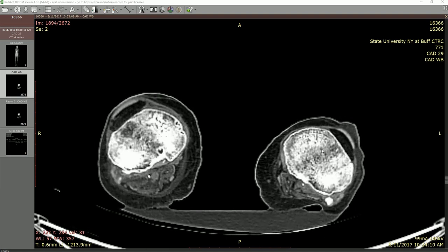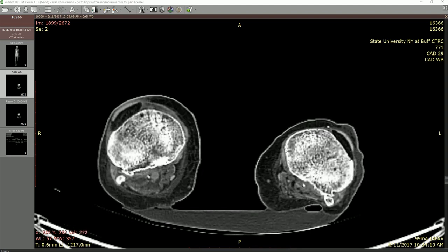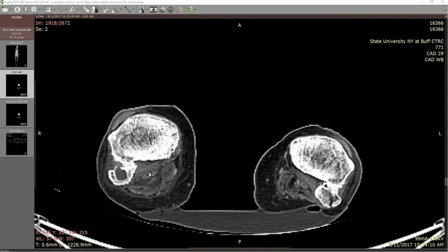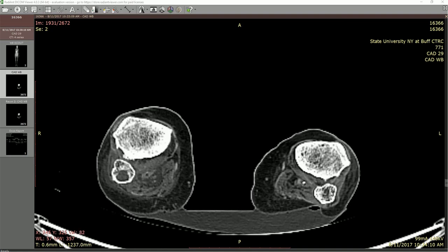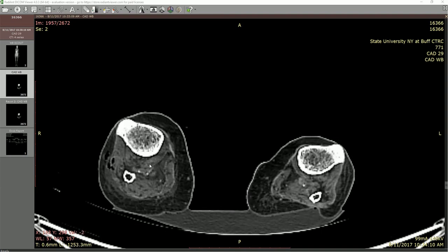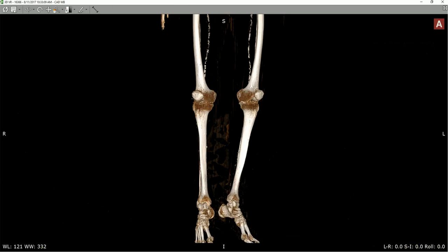Going a bit further, it becomes darker as we get more into that spongy bone tissue. Just a bit further down, we start to see the articulation with the head of the fibula. Continuing down, we're into the lower leg region. To keep things in perspective, similar to what we saw at the forearms, note that in this individual they're somewhat externally rotated in the left hip. So consequently when we look at the lower limb, the anterior compartment is going to actually be seen laterally and the posterior compartment will appear more medially — not in proper anatomical position as traditionally taught.